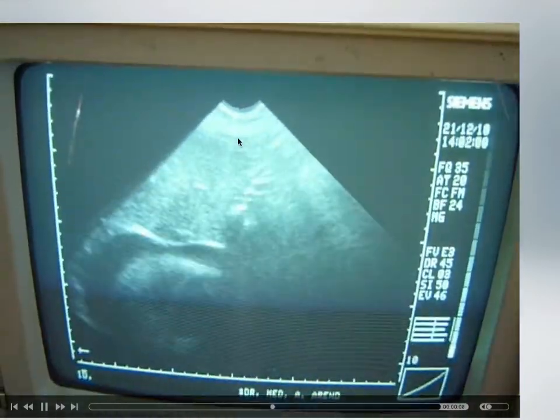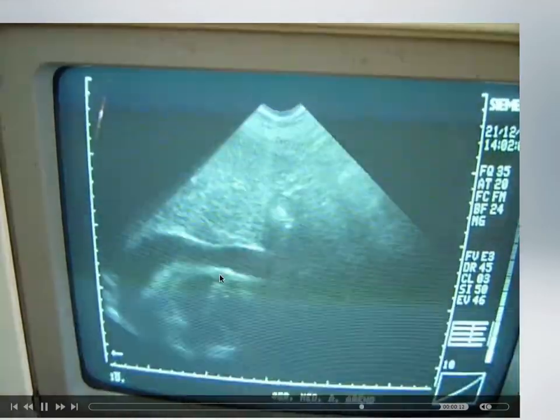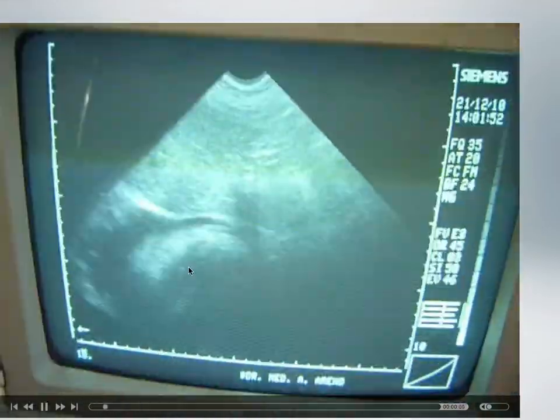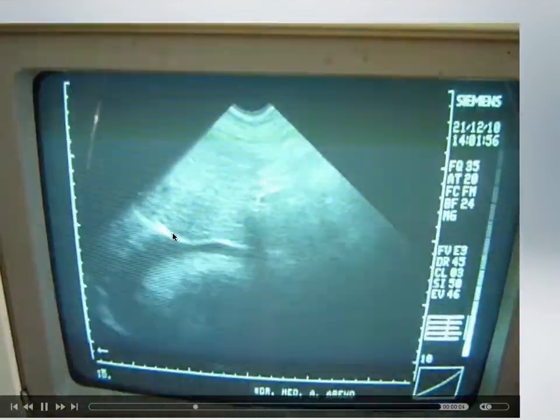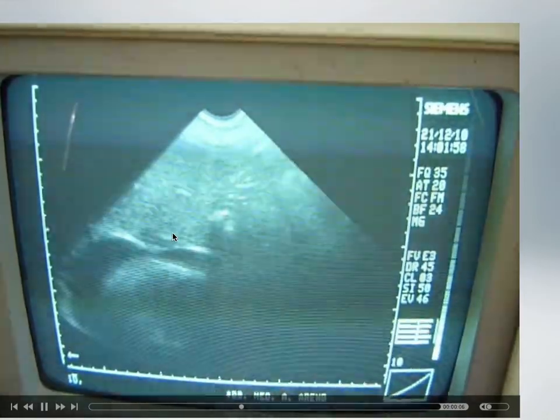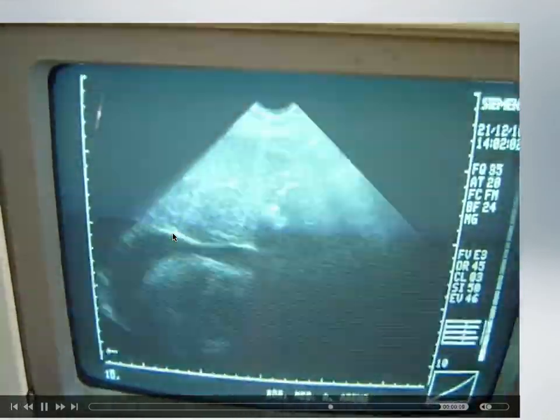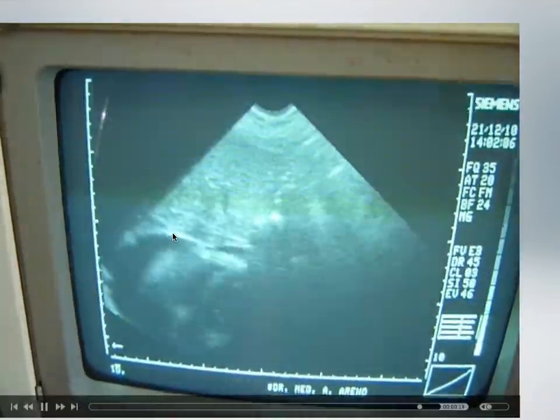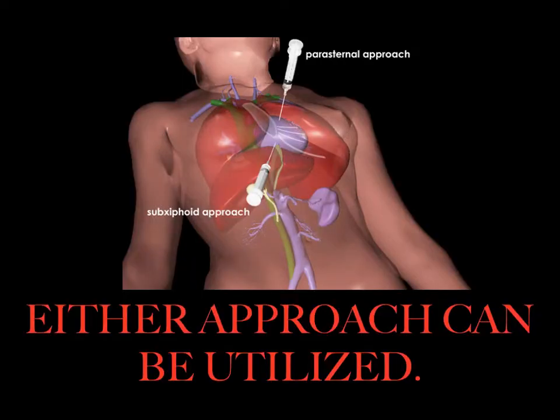this is the liver here, so it's subxiphoid. And here's the heart, septum over here. You can see some diastolic collapses. The heart is swinging back and forth inside this large effusion. So this patient's shortness of breath was more than likely not due to her asthma being kicked up by the harmattan or the sands. It was due to her renal disease causing a very large pericardial effusion and tamponade.